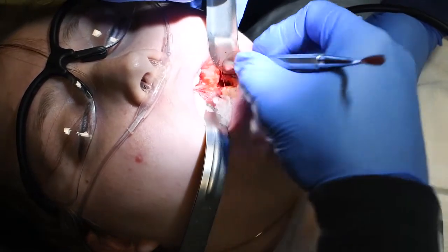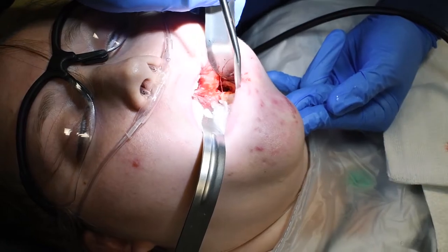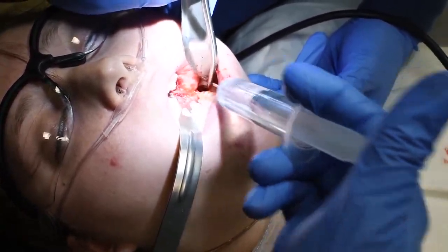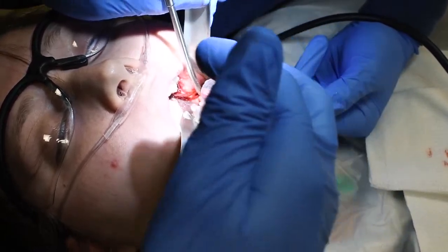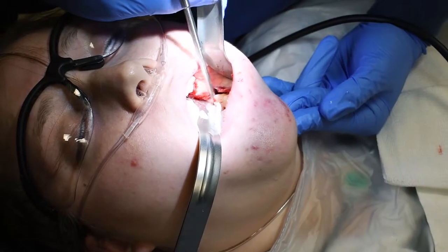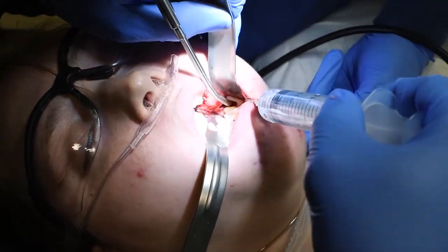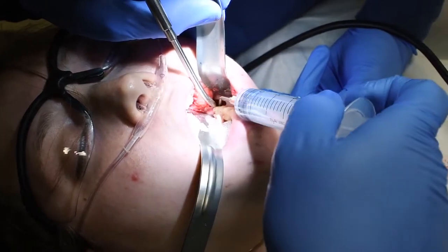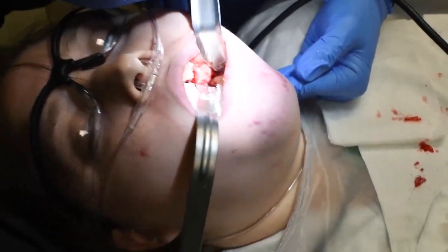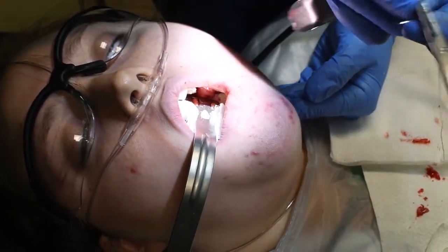Bone file — we've got to make sure things are smooth. Then we get a big rinse to make sure there's no debris, no pieces of tooth, no pieces of bone, nothing underneath that flap. Jess has done a great job making sure things are clean and water isn't going south. Down on the oropharynx, I have a throat pack in place — that helps with that too. Then we'll put a stitch in there.